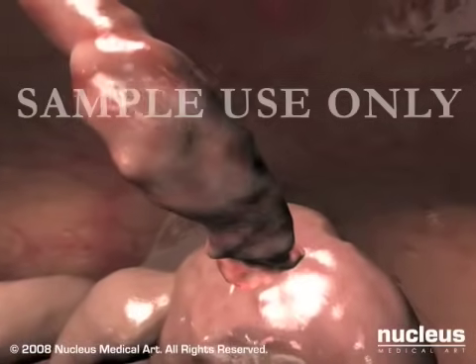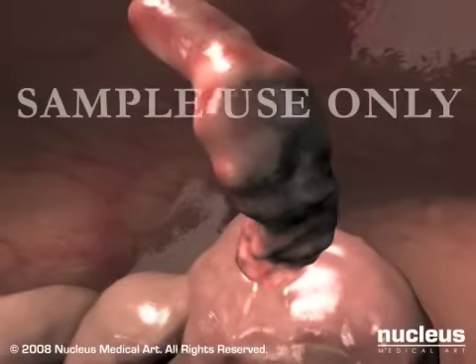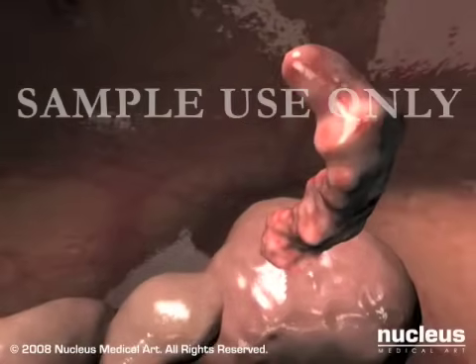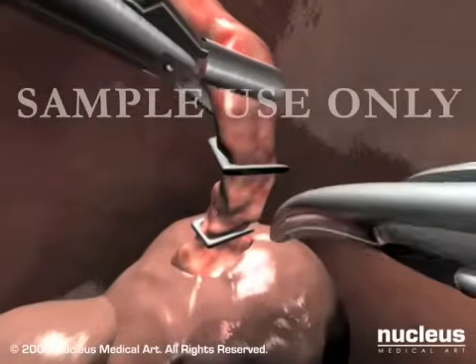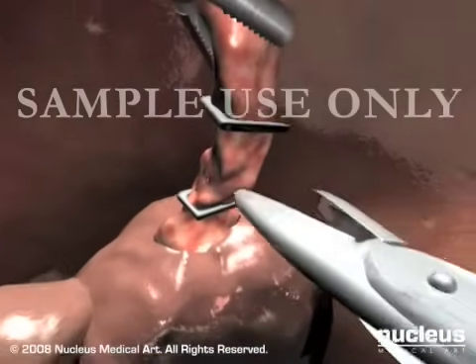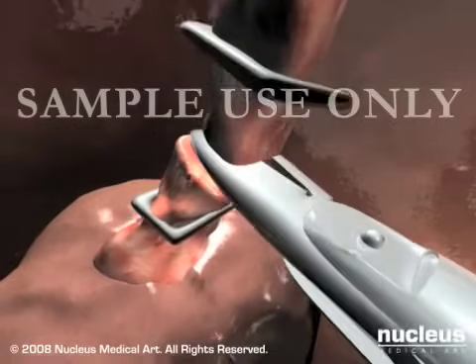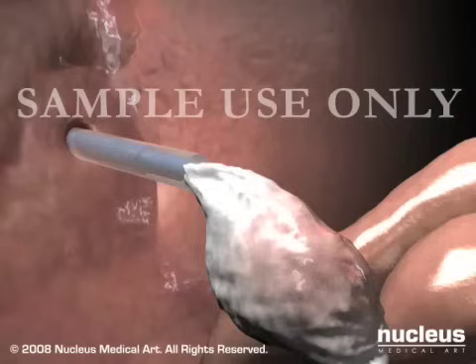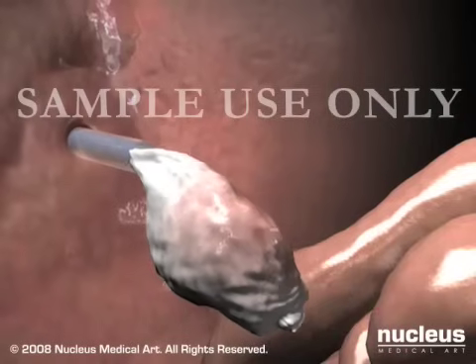Your surgeon will carefully examine the inside of your abdomen, confirming that your appendix is red, swollen, and needs removal. At this point, your surgeon will pass surgical instruments through the other two ports, grasp the appendix, separate it from the intestine, drop it into a specimen bag, and remove the specimen bag through one of the ports.